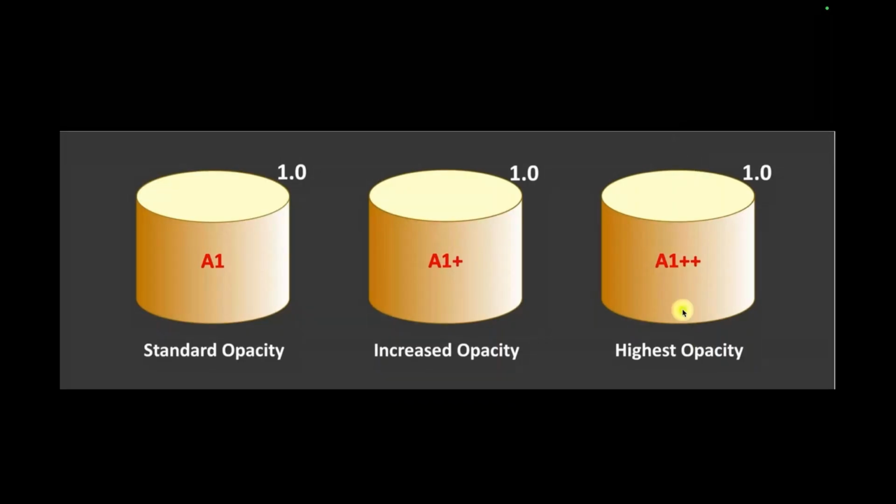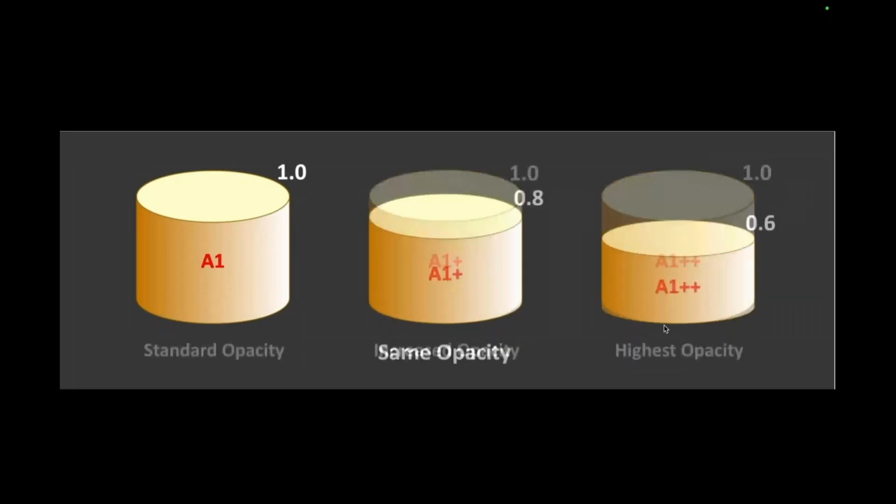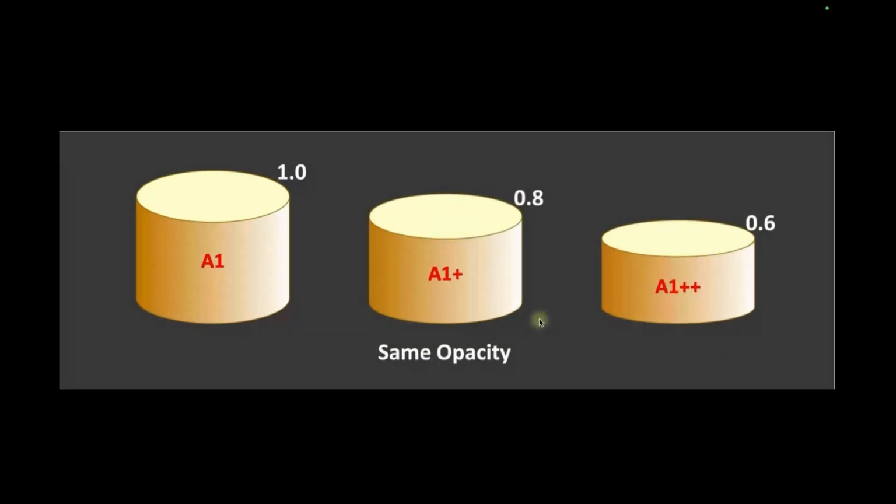But again, I only have that opacity at the thickness that I work in. You don't normally have that amount of thickness. So what starts to happen is, in order for me to get the same opacity, I need to change the ingot selections a lot of times. So my point with the case that I just showed you is, I might have to go with the most opacified ingot I have for that number 9, and then more of a translucent ingot for the number 8, to make those two work together, because otherwise the thickness of the materials is going to really change the game for me.